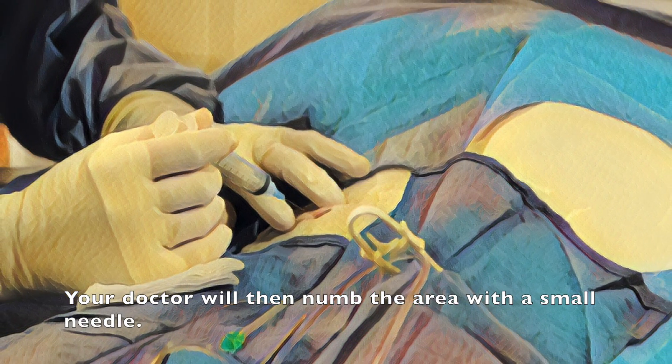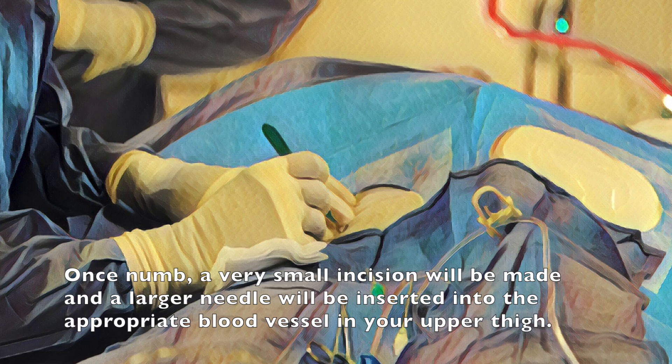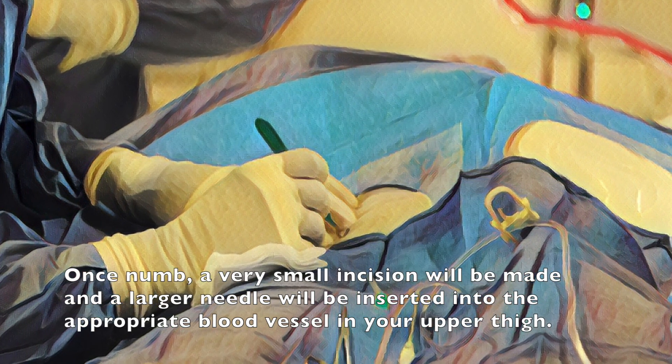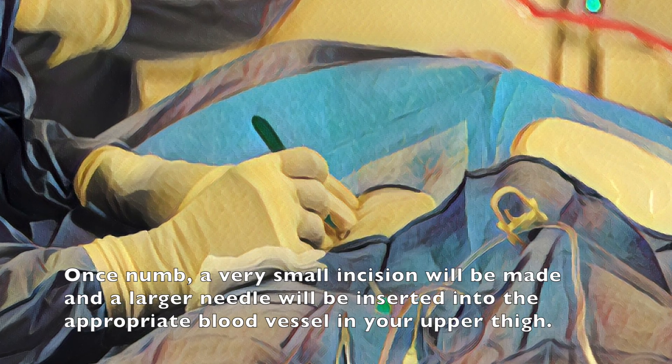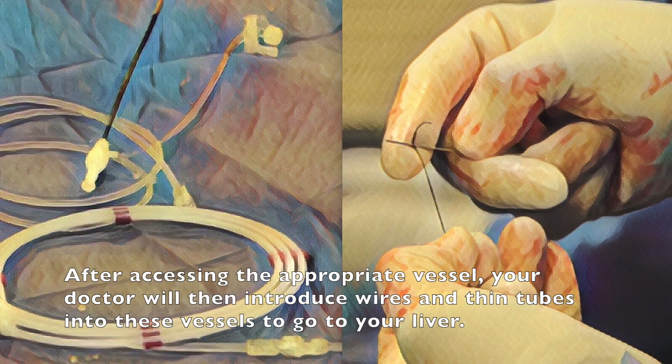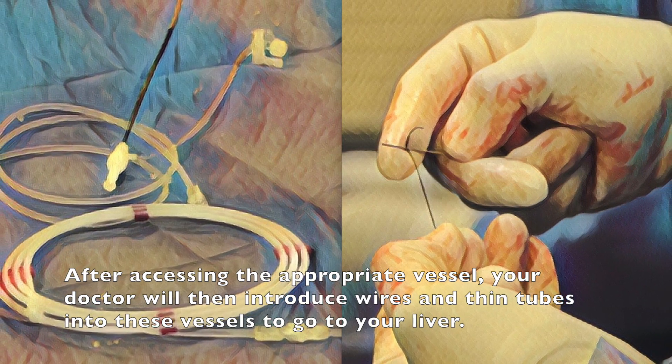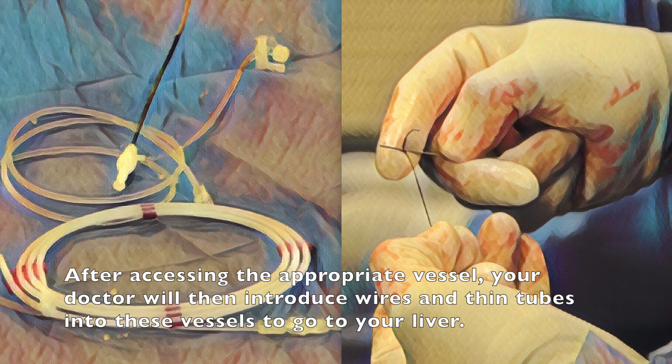The doctor will then numb the area with a small needle. Once numb a very small incision will be made and a larger needle will be inserted into the appropriate blood vessel in your upper thigh. After accessing the appropriate vessel your doctor will then introduce wires and thin tubes into these vessels to go to your liver.